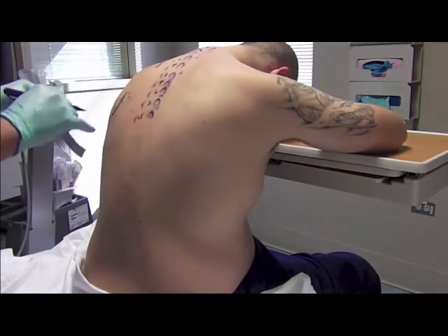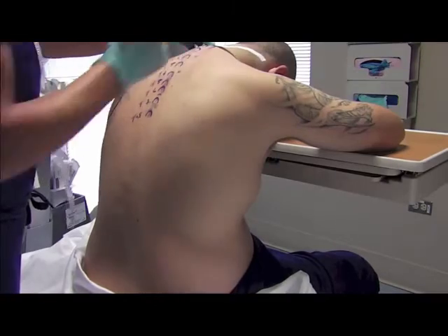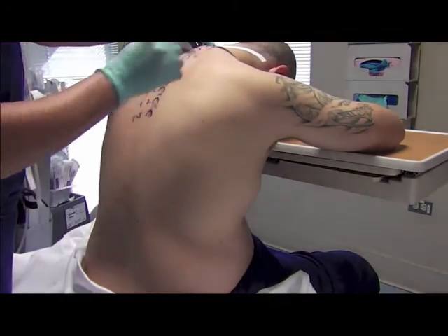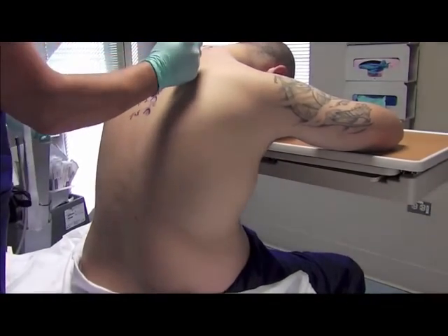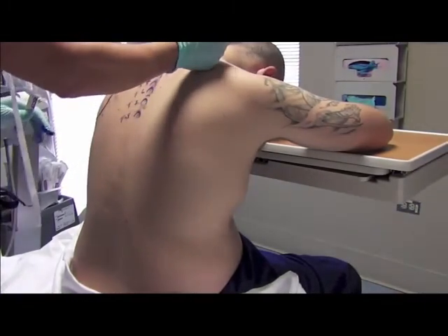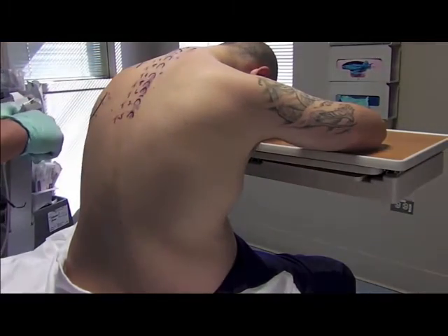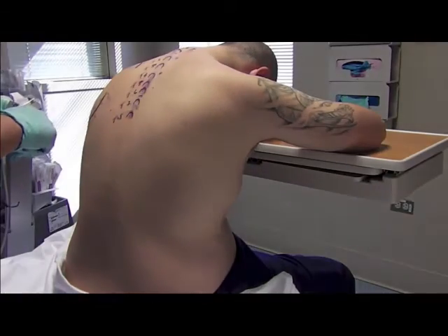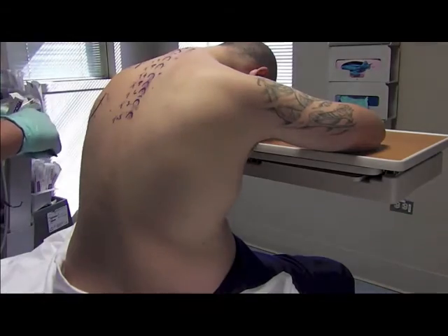For the placement of the block, if you're not using ultrasound, take a ruler and measure two and a half centimeters lateral to the midline on the side that you're doing the block and mark out that space. I've done it here for C7, T2, and T4. When we first started doing blocks at Stanford Hospital we would do single shot injections blindly at C7, T2, and T4. Now that we've gotten more sophisticated we do a single injection in the middle of the dermatome where we want the best coverage, and we place a catheter there.